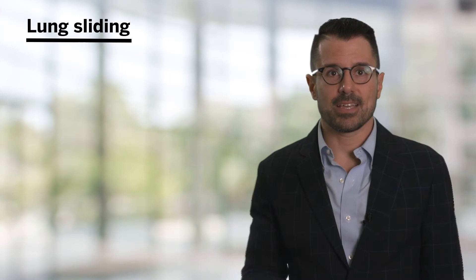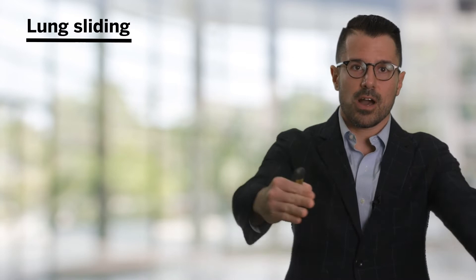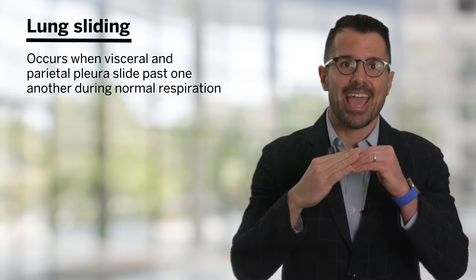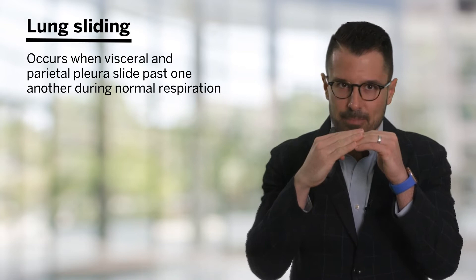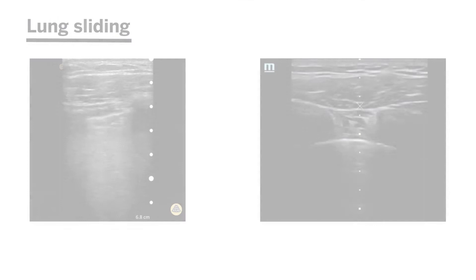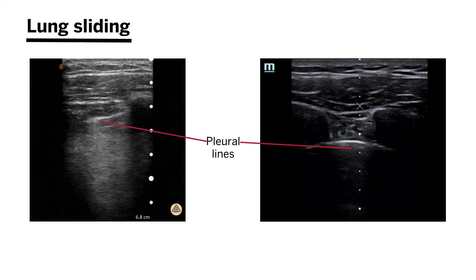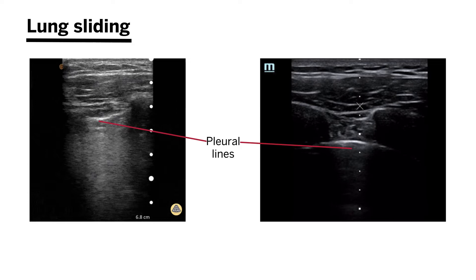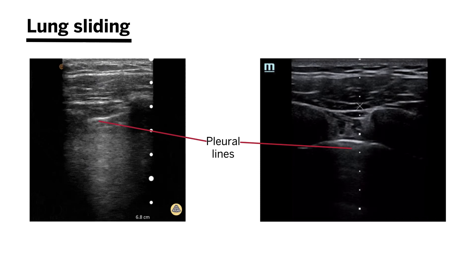Next up is lung sliding. Lung sliding refers to the effect we see when visceral and parietal pleura are apposed to each other and sliding past one another during normal respiration. Tiny microscopic imperfections in the pleura manifest as tiny little ants marching on a log. Focus on that bright pleural line and note these tiny little granules that seem to be moving with respiration — that is sonographic evidence of lung sliding, which is important for evaluating diagnoses like pneumothoraces.